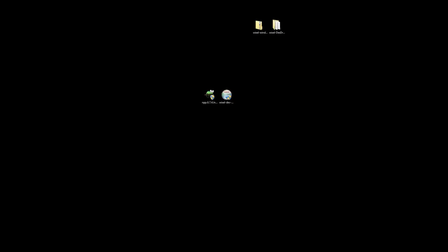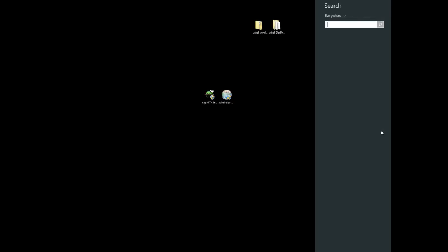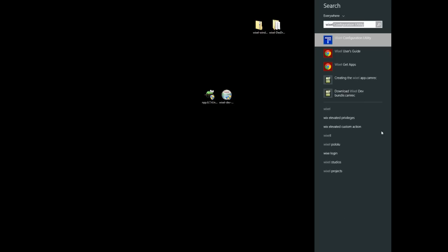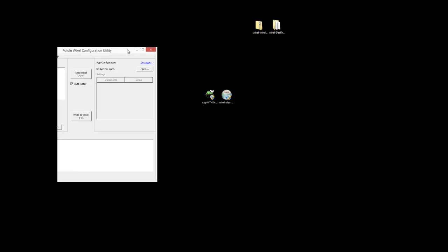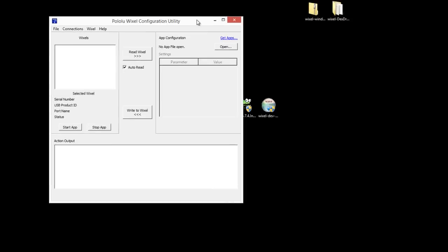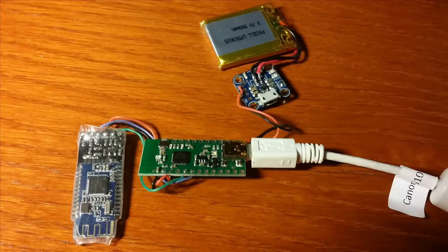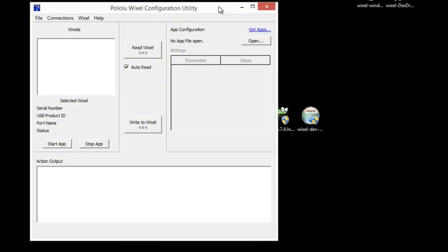Now we're going to write that piece of software to the Wixel. So we'll use the Wixel configuration utility. We'll open that up. And next thing we want to do is to connect our Wixel using a mini USB connector. And once we do that you'll see it on the left side there.